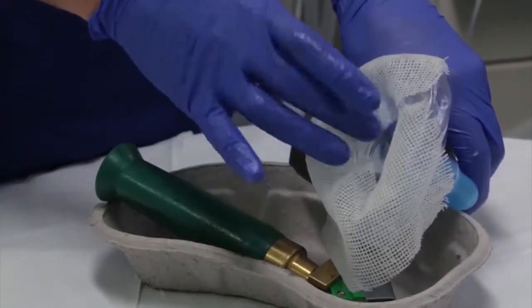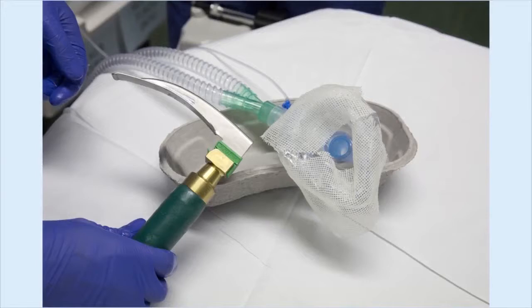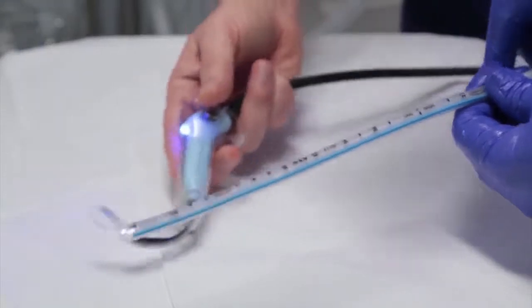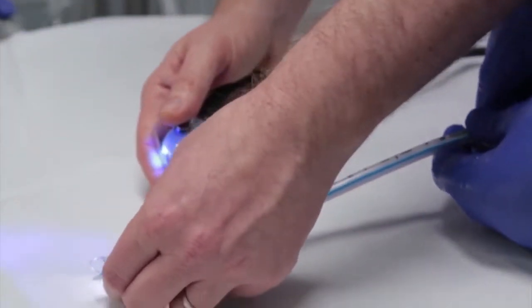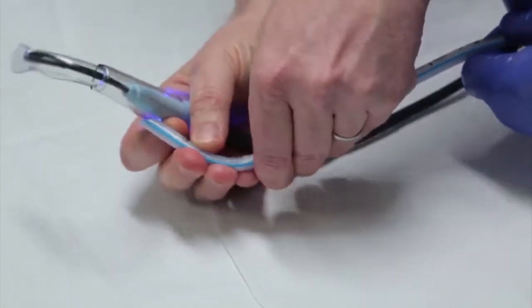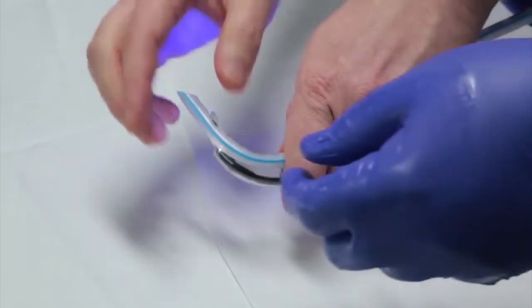At Birmingham Children's Hospital, three quarters of our patients with EB are induced with inhalational anaesthesia because of associated difficult intravenous access. Your laryngoscope should also be well greased. When the patient's mouth opening permits, video laryngoscopy allows excellent visualization of the laryngeal inlet whilst minimizing the trauma associated with standard laryngoscopy. This is now the preferred approach at Birmingham Children's Hospital.